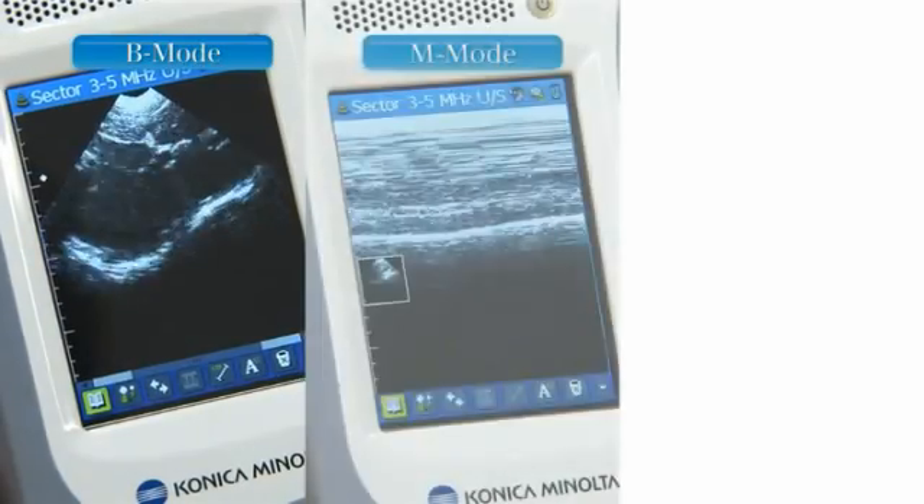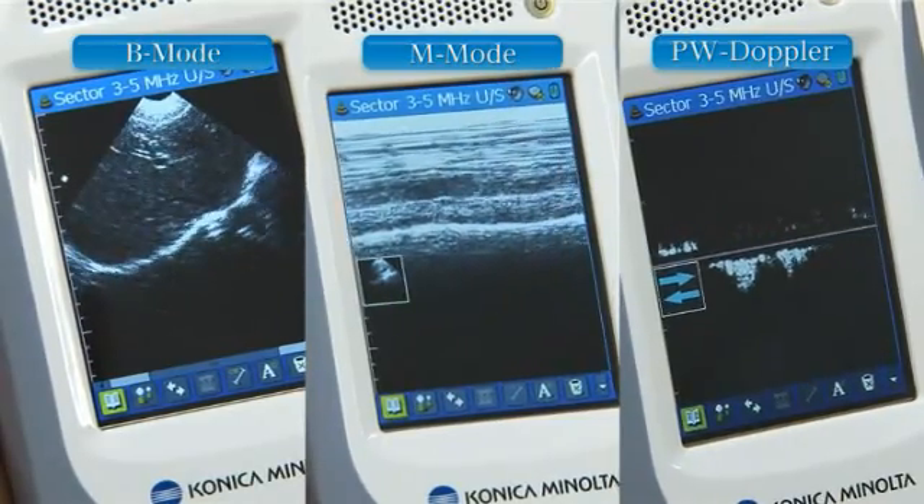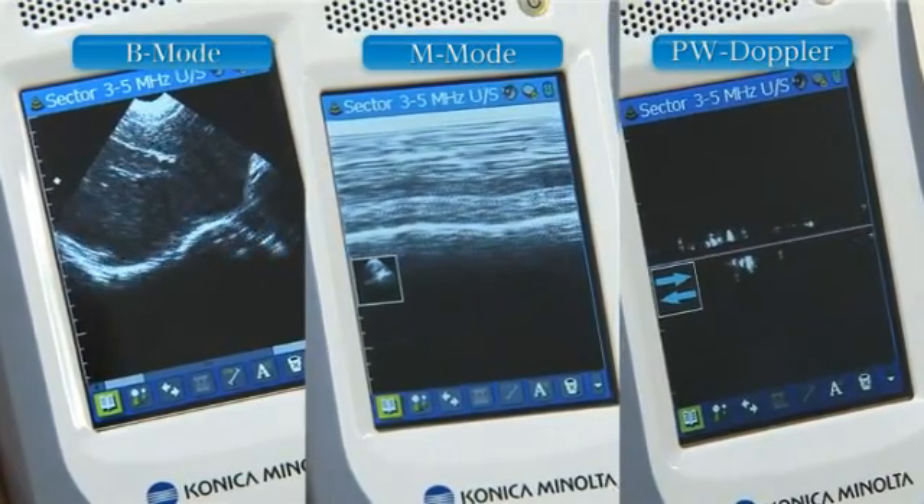Three modes are available: B mode, M mode, and pulse Doppler mode. Note that absolute flow speed cannot be measured in PW Doppler mode.